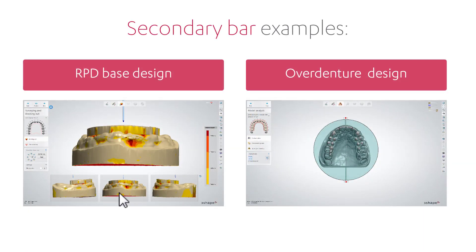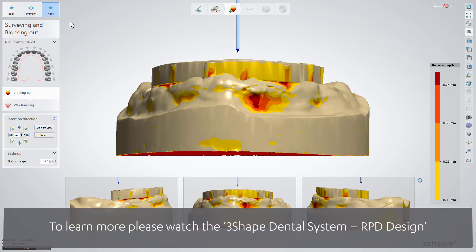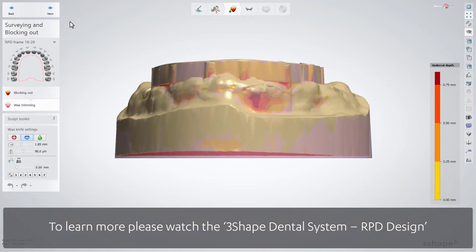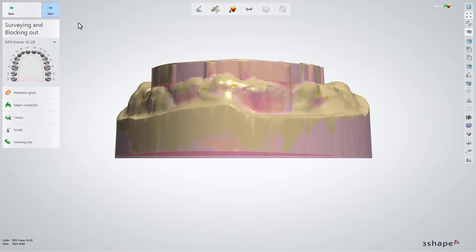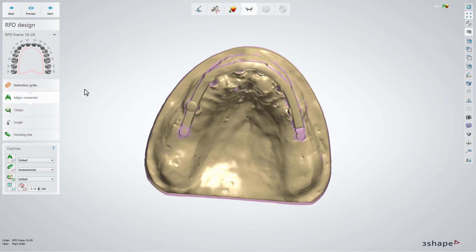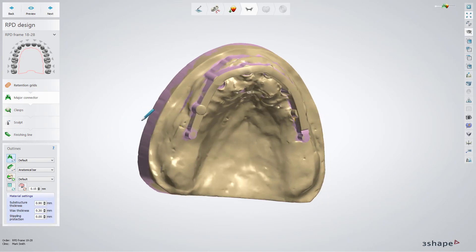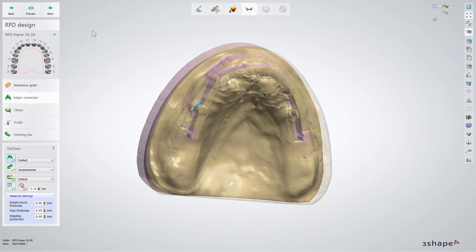Now we will show you what can go on top of the primary design bar. Start with the RPD construction that fits the bar. Set the insertion direction and the block-out angle if needed. Click Next to go to the Wax Trimming sub-step, where you can add, remove, or smooth applied wax. When you are ready, click Next to start designing the restoration itself. Go straight to the Major Connector sub-step to create a secondary construction plate. Click on the Draw button and place the outline for the Major Connector, then click Preview to see the outcome.